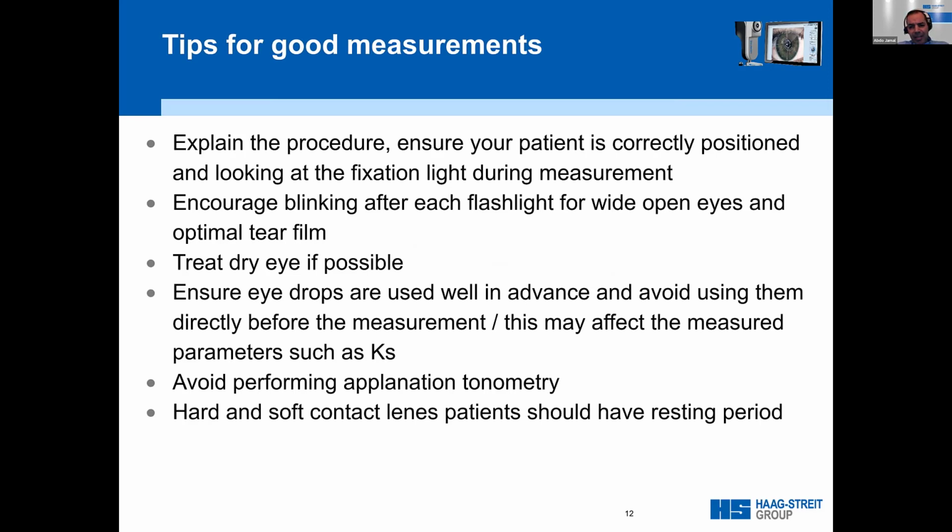So, as mentioned earlier, Lenstar helps surgeons achieve the best outcomes for their patients. But in order to produce highly accurate measurements, we should pay attention to a few things. First, I think we have to consider that the patient is nervous when he walks into the clinic. He or she doesn't know what he will experience in front of the device.